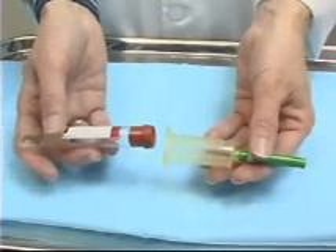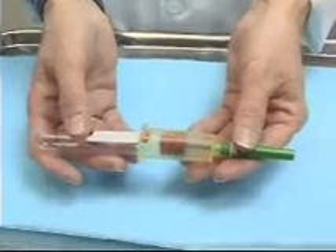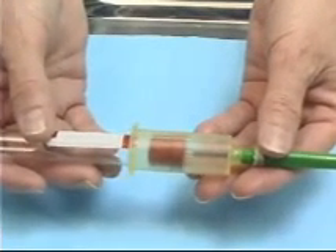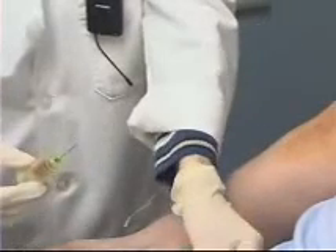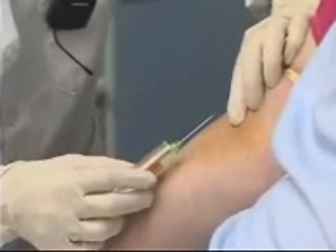I'm going to rest the blood collection tube inside the vacutainer holder, just abutting the end of the tube to the needle. I'm going to remove the protective cap from the needle, checking again that I'm going bevel up.